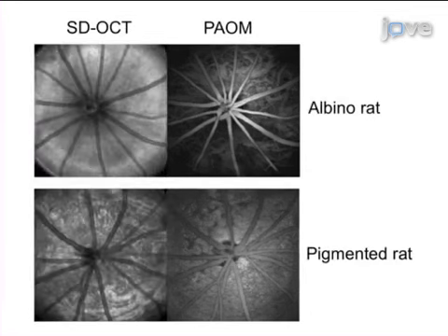Ultimately, the optical absorption contrast and optical scattering contrast from the collected images can reveal minute functional variations in the retinal circulation and pigment epithelium together with detailed retinal anatomy.